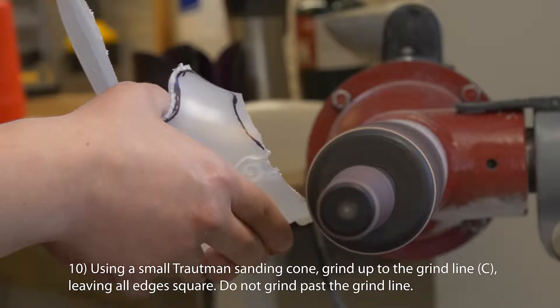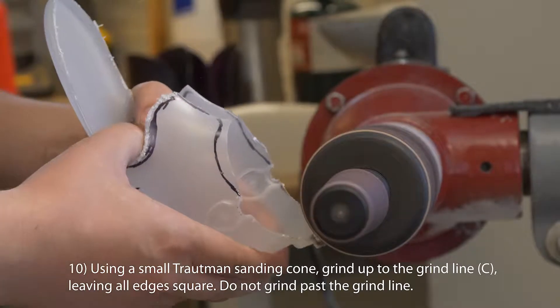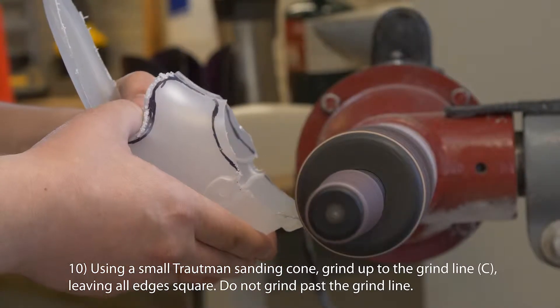Using a small Trautman sanding cone, grind up to the grind line C, leaving all edges square. Do not grind past the grind line.